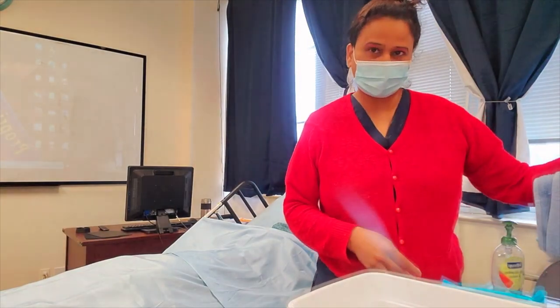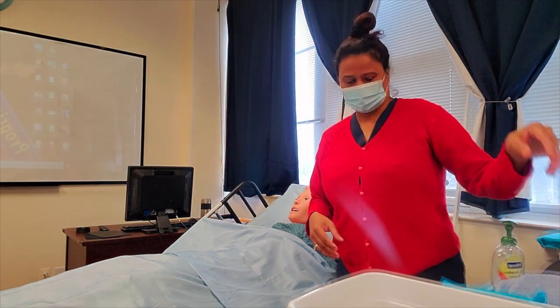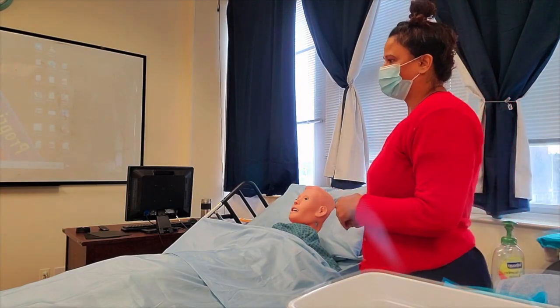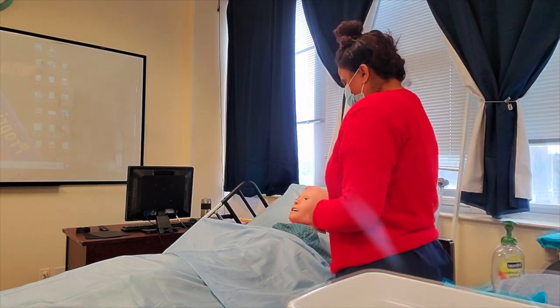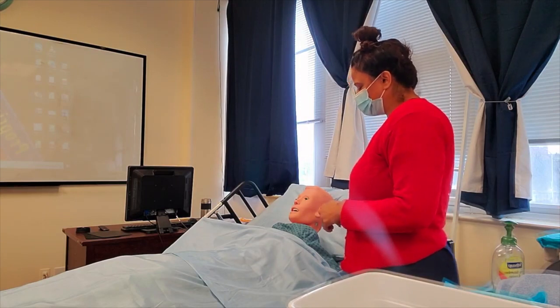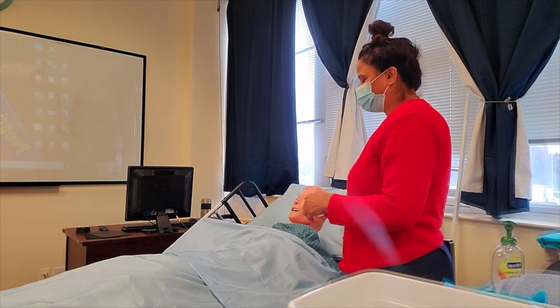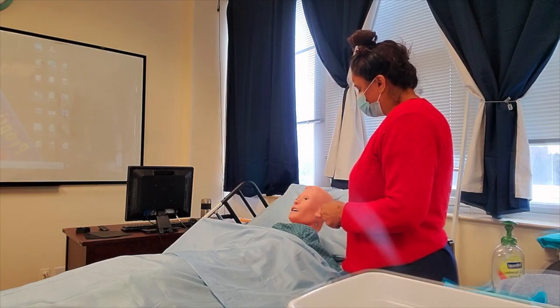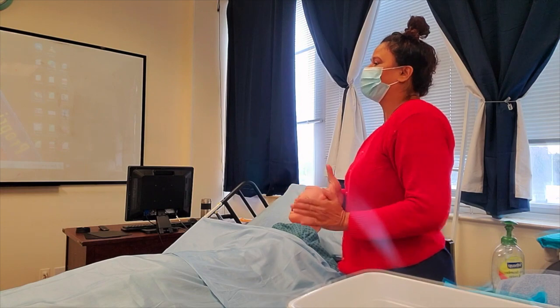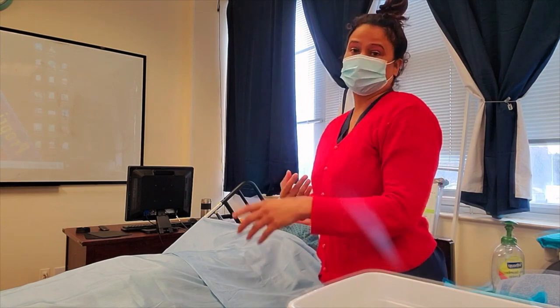I also have a privacy towel. Now I'm going to greet my patient. Hello, good morning, how are you? My name is Miss Henderson. I'm going to be your CNA today and I'm here to clean your Foley catheter — is that okay? I'll be right back to wash my hands and gather my equipment.